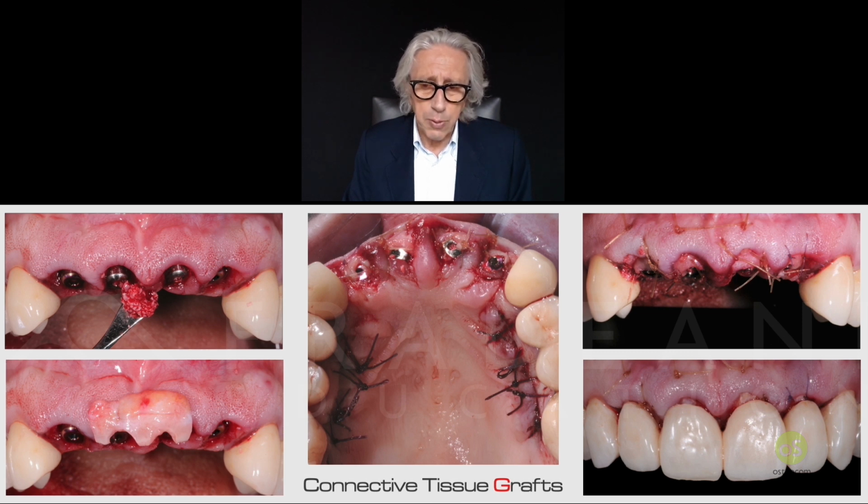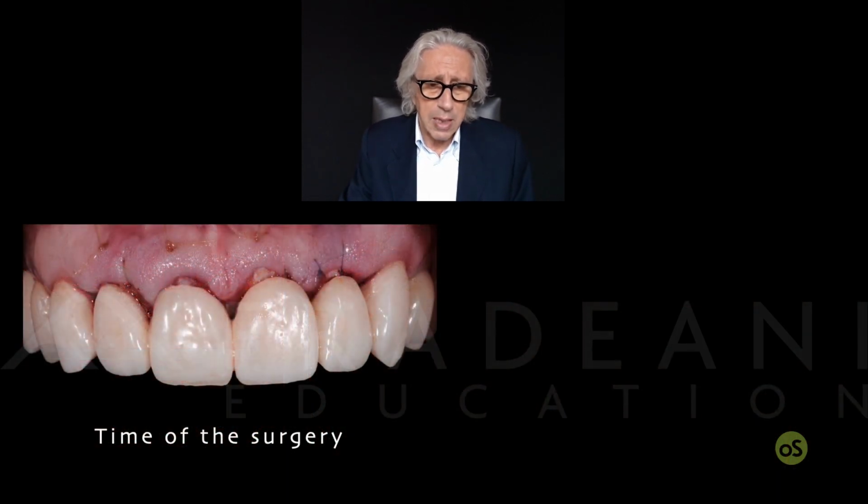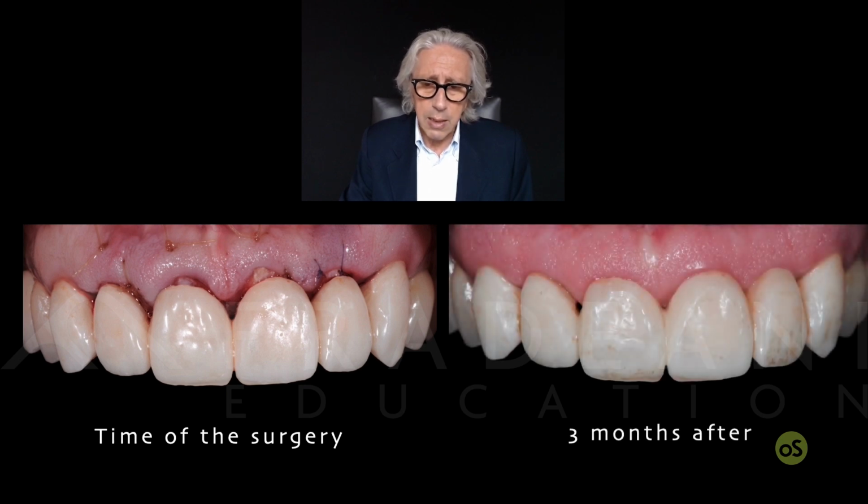So at this point we did this provisional. We positioned the provisional close to the implants, but not really touching them, not loading them. The time of surgery was with the provisional in place. And after 3 months, again, with this provisional in place, we are waiting for the osseointegration of the implants to do the loading of the 4 implants anteriorly and remove the 2 cuspids to put 2 other implants on the 2 cuspids.